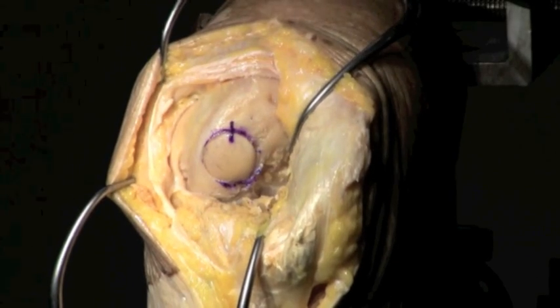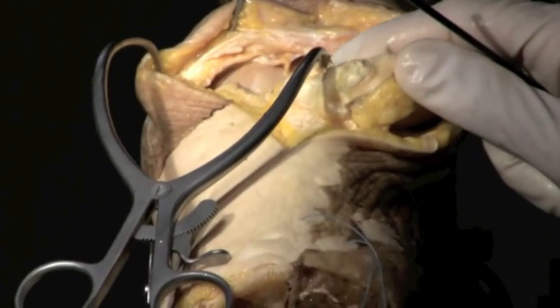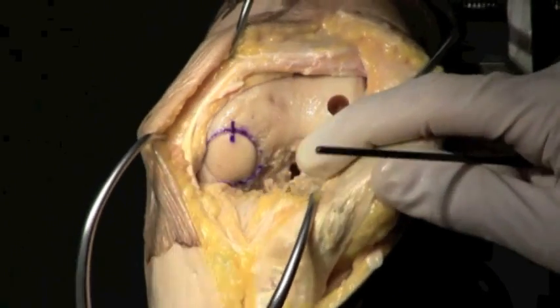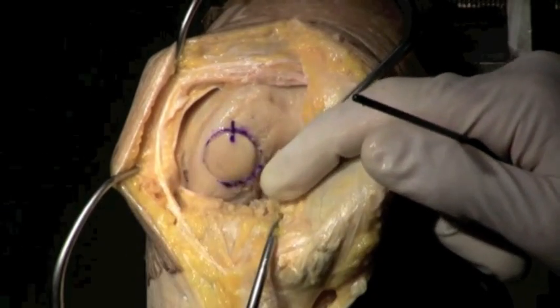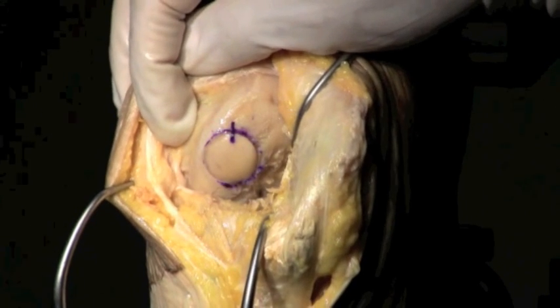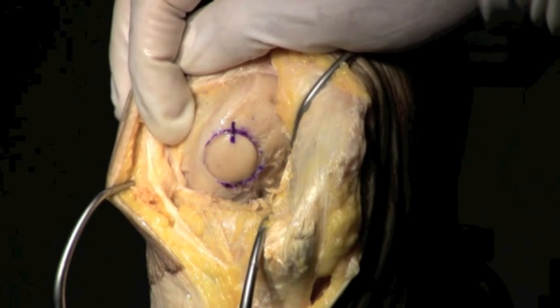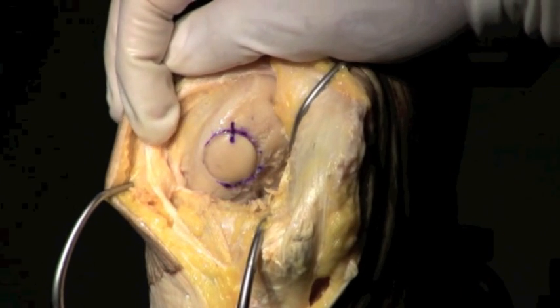So it looks great. Now this part will bear the weight. Of course, when the person straightens out the knee, that's the part that bears the weight, and that's a major weight-bearing part of the surface. And we've now reconstructed that with the cadaver graft. So that is called an osteochondral, osteo-bone, chondral-cartilage allograft, which is a cadaver graft.